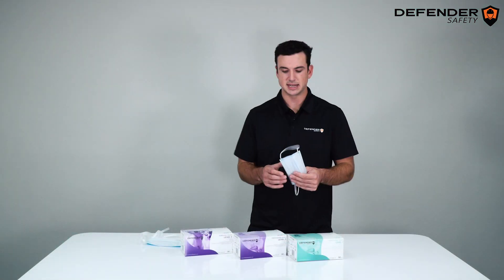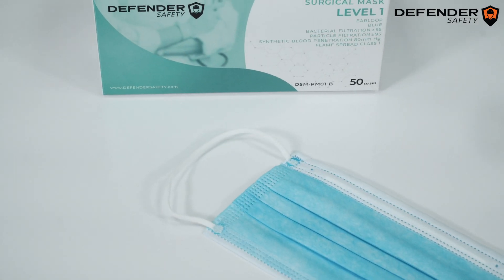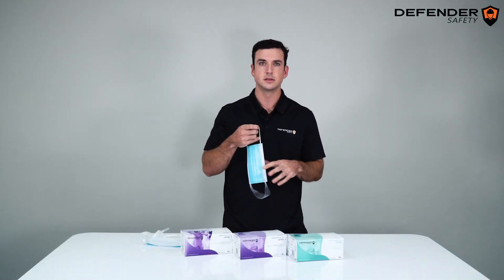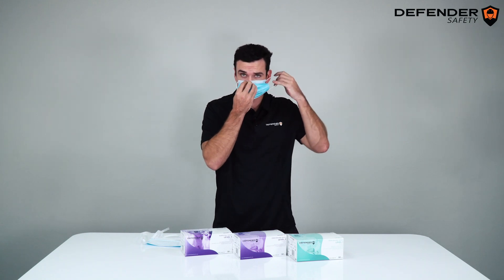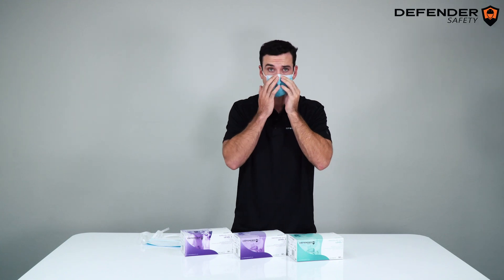Now, if you look at the mask itself, the first thing you will notice is our flat ear loop designed for comfort and high-performance tensile strength. I'm going to stretch this here. As I put on the mask, you can see that the nose piece holds its place and contours to the nose for a perfect functional seal.